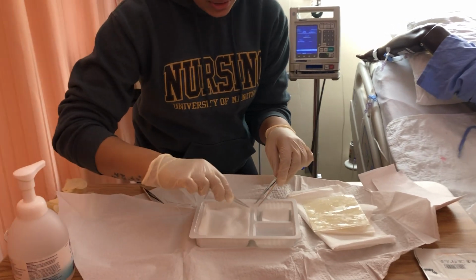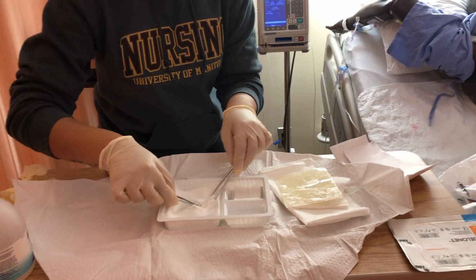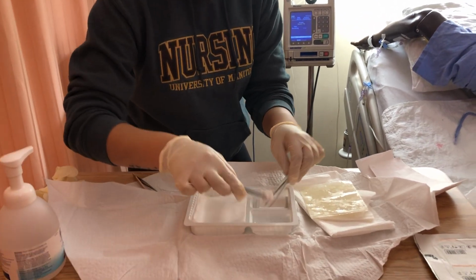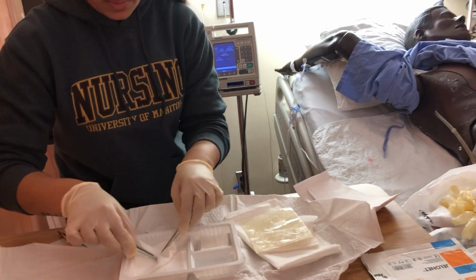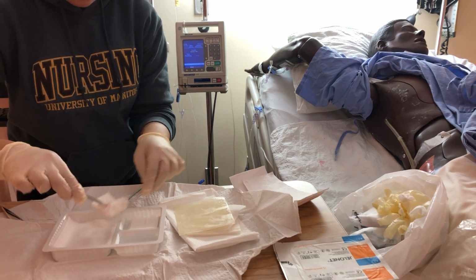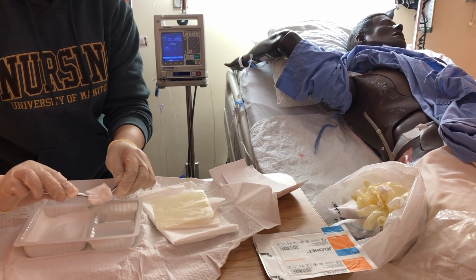The rest of it I have cleaned. Now I'm going to clean the tube. The most important is the middle. Just tuck that in here, and then I'm going to get my mefix. I actually use my fingers at the top. Just one swipe down. And then I'm going to just clean it one more time. Airtight. And then my second one here.